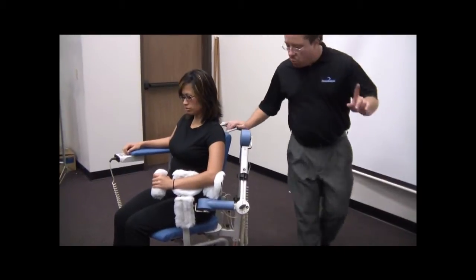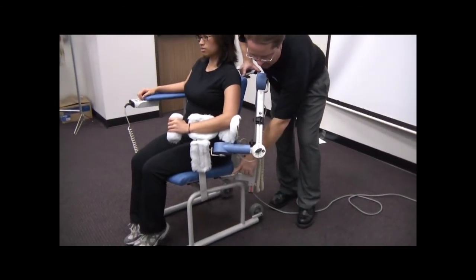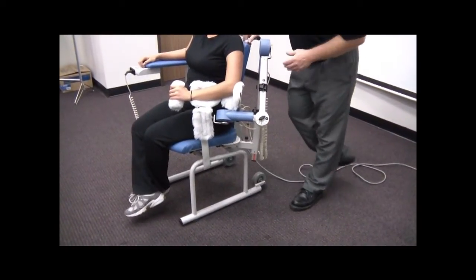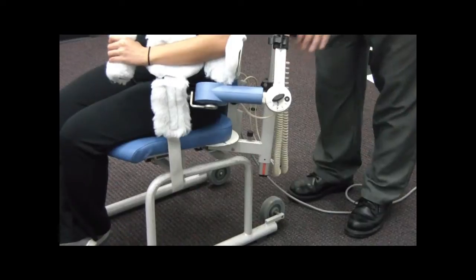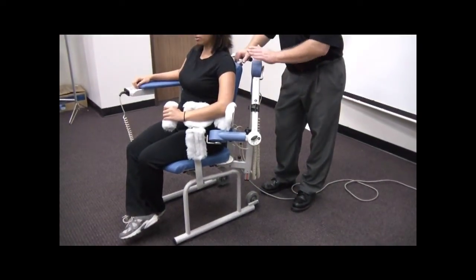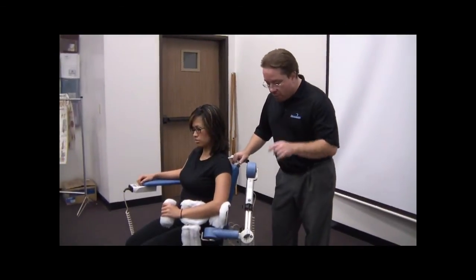Now, we're going to go back to, remember, our 5 settings. The number 1 setting down here, again, we're always going to be in the 30 to 50 degree range. And for Ann, at the 40 that I typically start at, I think she's going to be fine. So I'm going to leave it there, and then I will come back to that at the end here. We're going to move on to number 2.